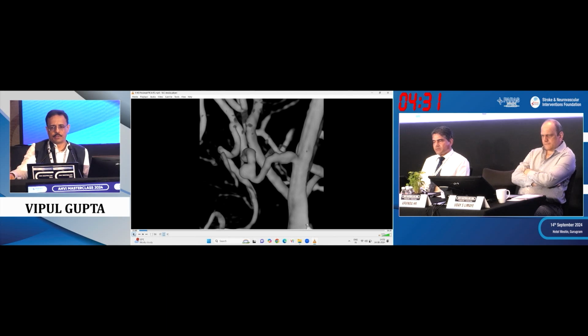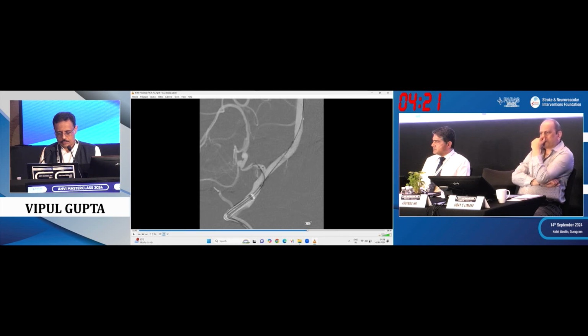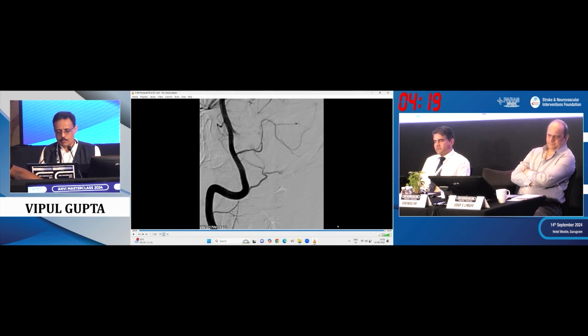Anything we could have done differently, the stenosis phenomenon? Can you show us the angiogram with the stenosis? The last one? Yes, just to understand what happened. I don't have better. Where is the stent here? So the stent is here, up to here, I think up to here, and there's a lot of in-stent stenosis. The artery has become smaller as well overall.